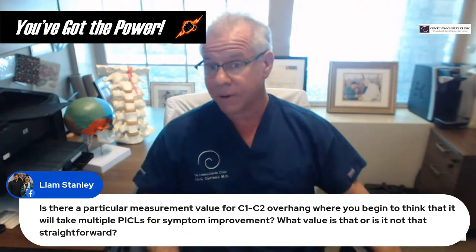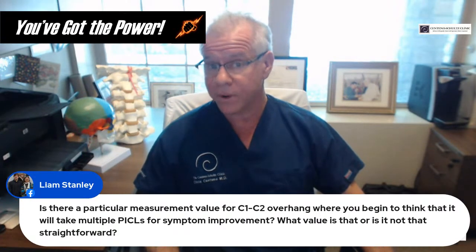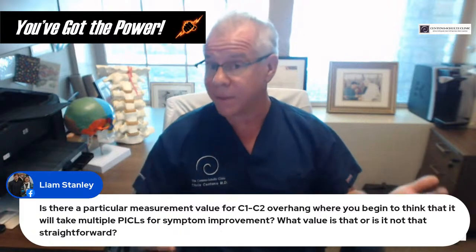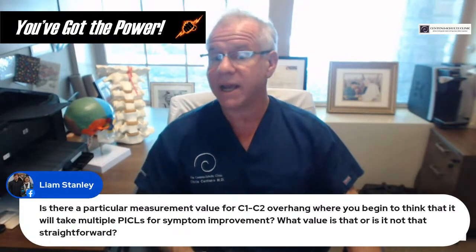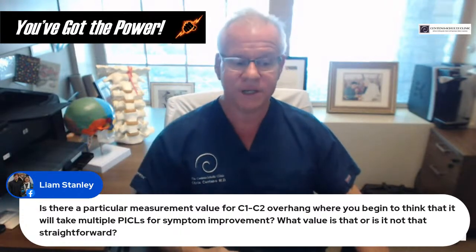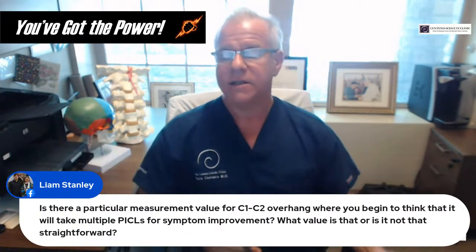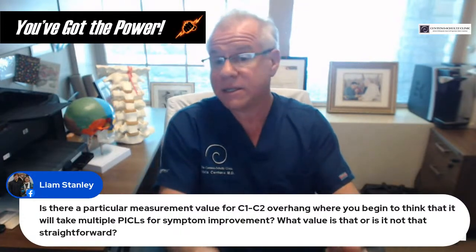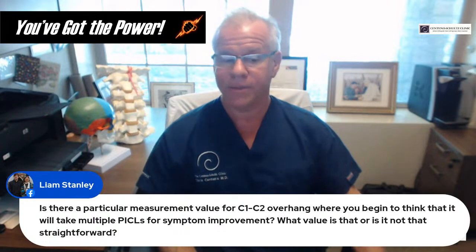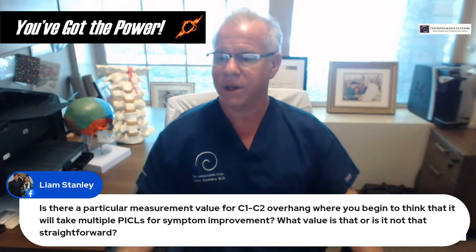I would say that in general, what we tend to see is about a 25% reduction in overhang per procedure. And that's in responders. So let's say you're a responder and you have 6 millimeters. If we take 25% of 6, after the first procedure you go down to about 4. For the second procedure, you go down to about 2.5. And the third procedure, you go under 2. So now you can see that if you've got a 6 millimeter overhang, it's going to take about 3 procedures or so. Obviously, everyone's different. That would be less if you had a 4 millimeter and more if you had an 8 millimeter. That's kind of how all this goes.